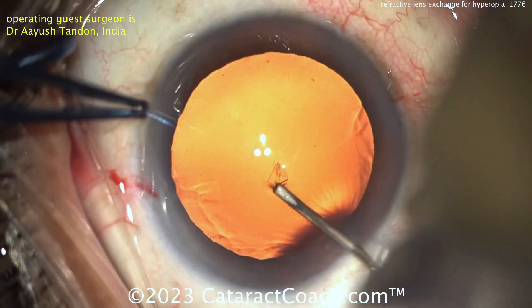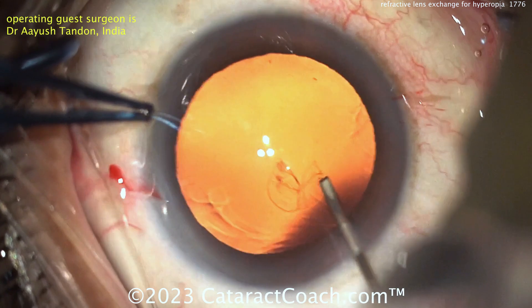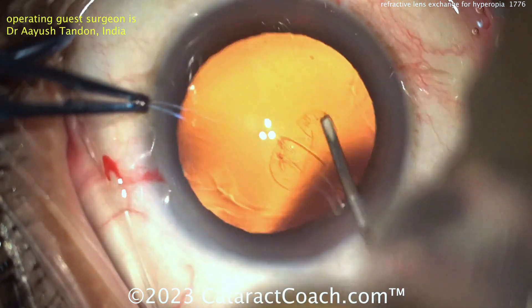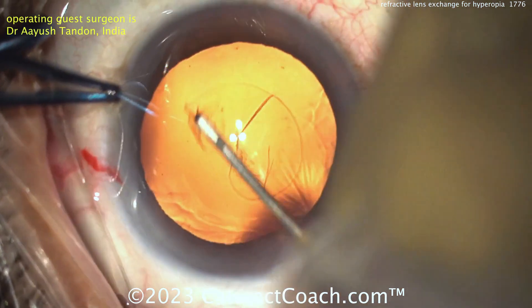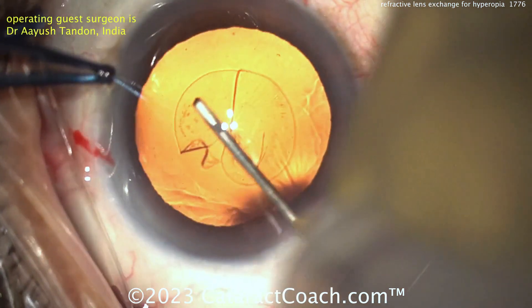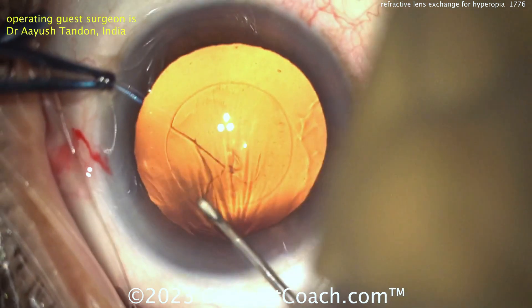Starting off the rhexis — it's important to get a beautiful rhexis in someone who's paying out of pocket for a refractive lens exchange. Nice technique here with the cystotome, bringing that around. Looks like it's going to be a 100% cystotome rhexis. Looks pretty good — nicely done.